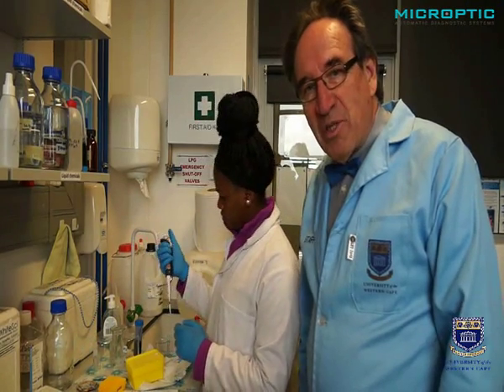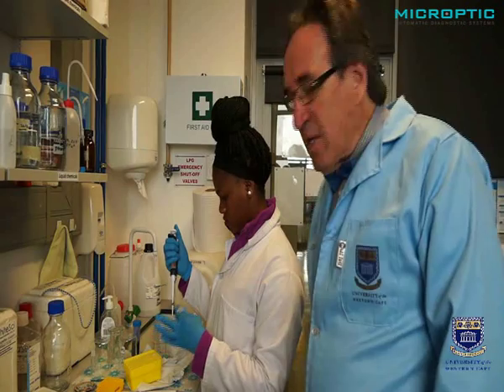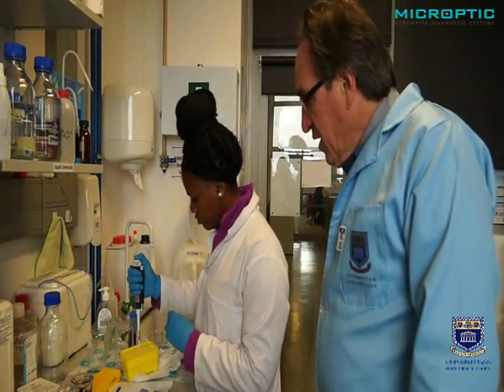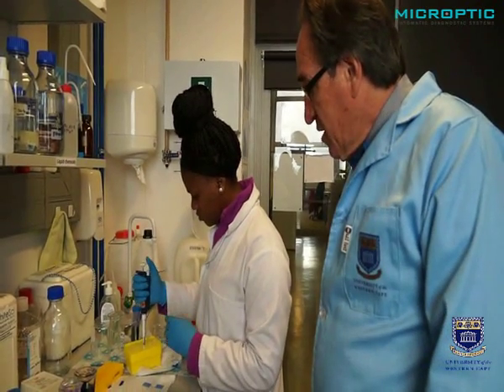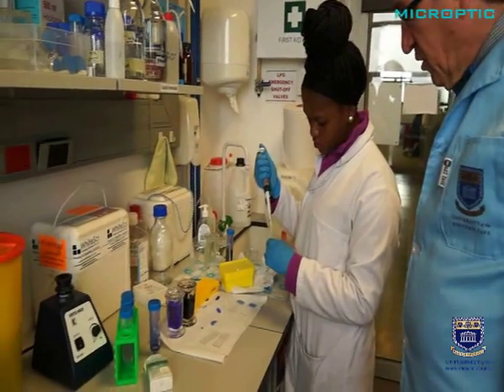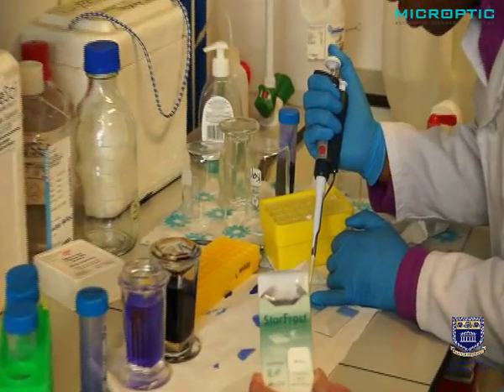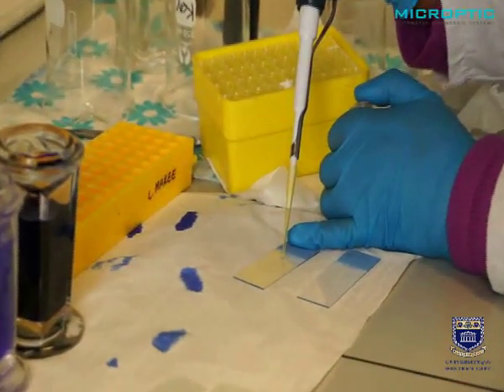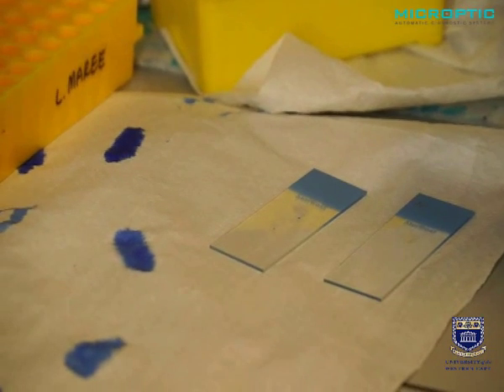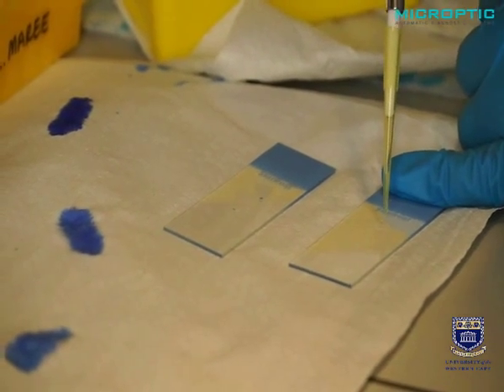Now that we've completed the motility, we're going to show you how to make a proper sperm smear. Asanelli is going to take 10 microliters of the raw semen, the neat semen, and she's going to put it on the side of a so-called Star Frost slide. These are Star Frost slides. They are electrically treated to adhere more sperm. She's going to put 10 microliters also on a duplicate slide of the Star Frost type.